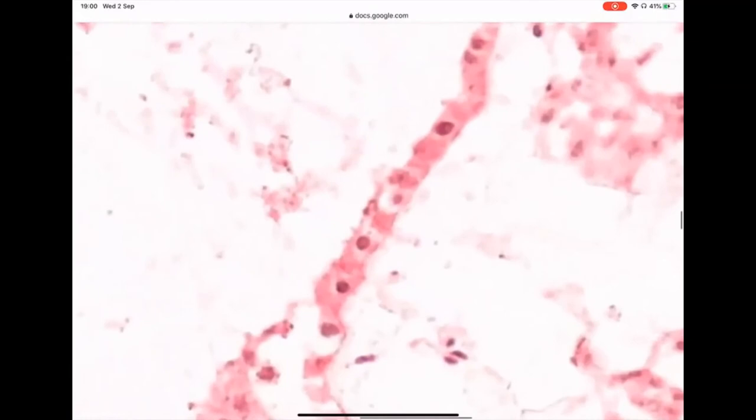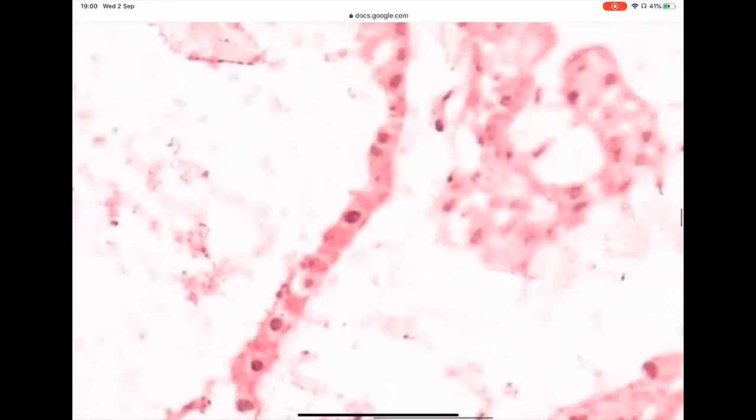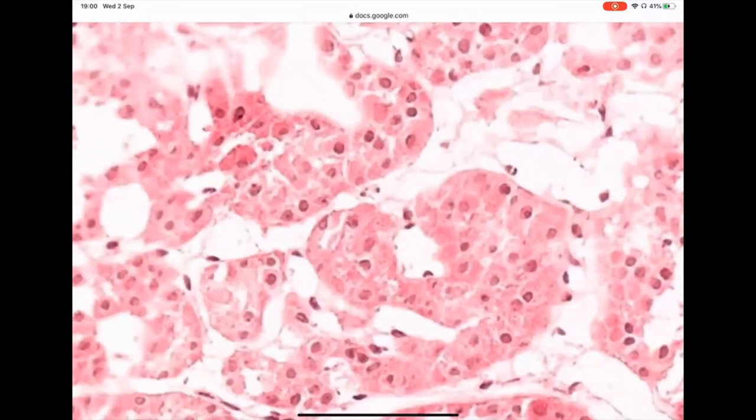And this is a little bit of a close-up on this type of cells so that you can see. The cells look a little bit monotonous. And you can see that surrounding these cells there is a cytoplasm that's not clear. So at least I can say with some degree of confidence that these are probably not clear cells. And the majority of you might agree that in a field like here, in the middle of the field, these cells have eosinophilic cytoplasm.